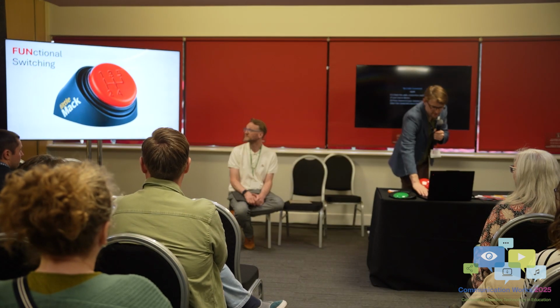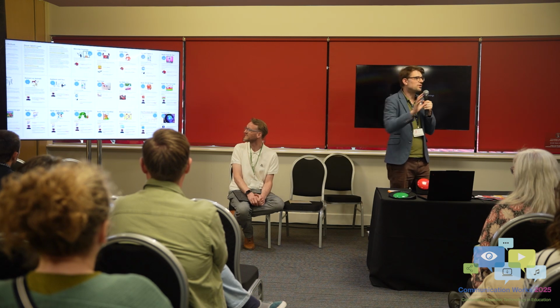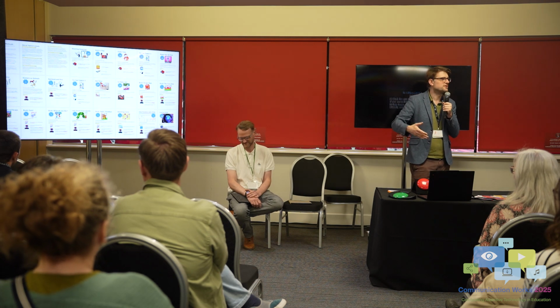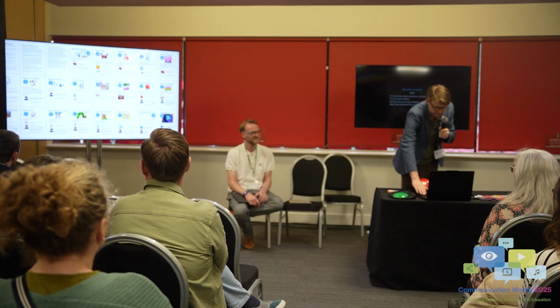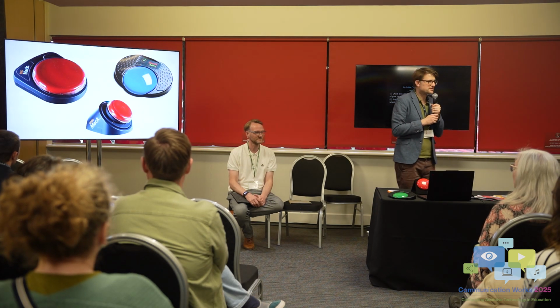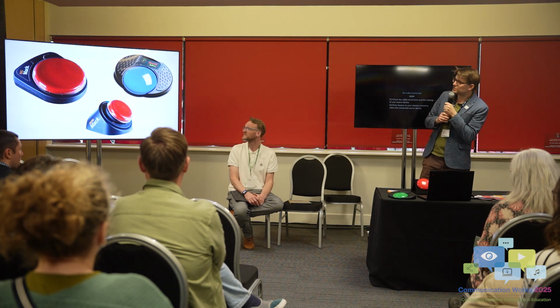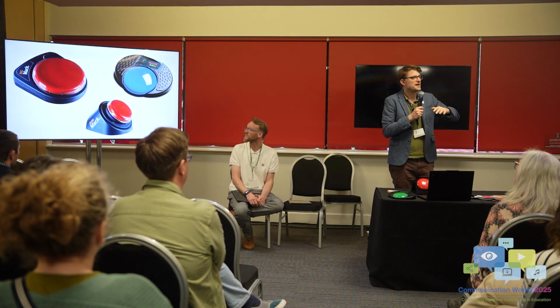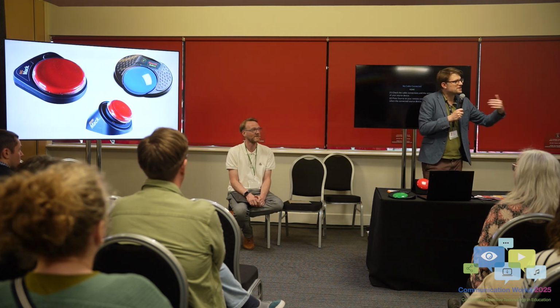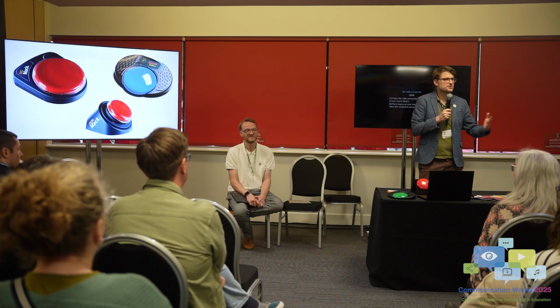Behind all of this is an activity book, which is available on the CENMAC website, and all the activities are divided according to each gear. Okay, so if you're in first gear, you can do first gear activities, second gear activities, etc. We really promote the use of single message devices, or whatever we want to call these things, like Big Macs and Smooth Talkers, because they allow the activities to be stories within the classroom, or activities that involve peers, or activities that involve the family. And you don't need to worry about having a computer and software and an internet connection.